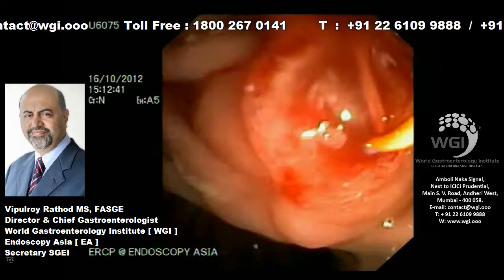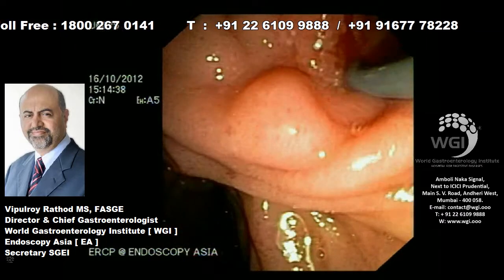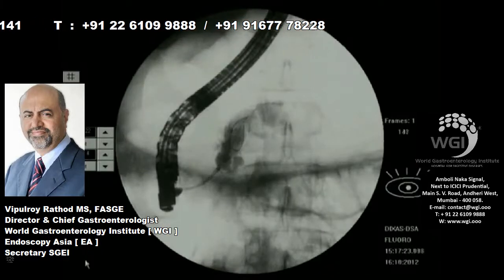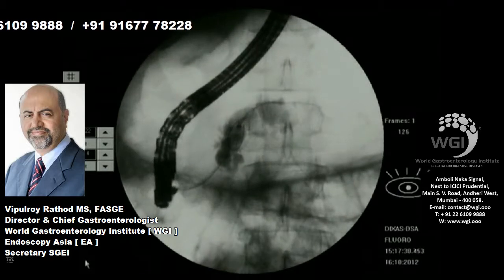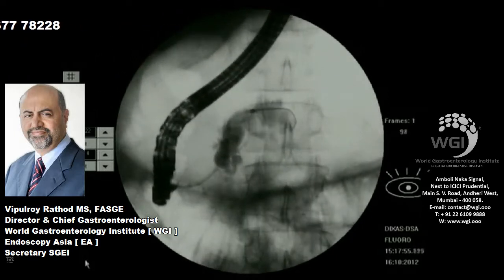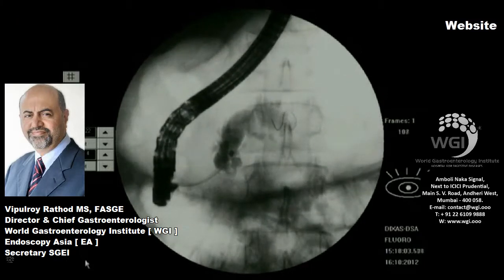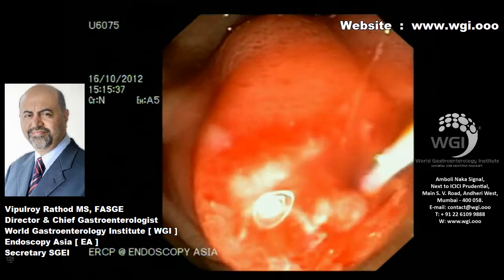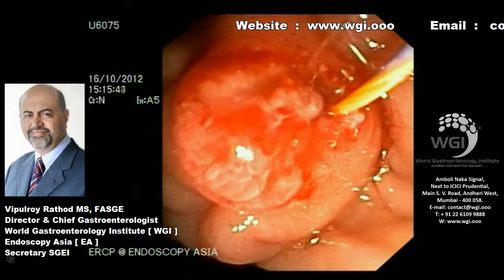So this is a pilot endotherapy, and as you can see here, after pancreatic sphincterotomy, we felt that there is a massively dilated system. Patient has severe inflammation in the head, and he has recurrent acute on chronic pancreatitis leading to duodenal narrowing. We preferred to put a 10 French Teflon stent on the pilot endotherapy protocol. So we do choose in dilated systems like this to go ahead and place a 10 French stent initially rather than going for a smaller stent, because it serves dilatation as well as very, very effective.